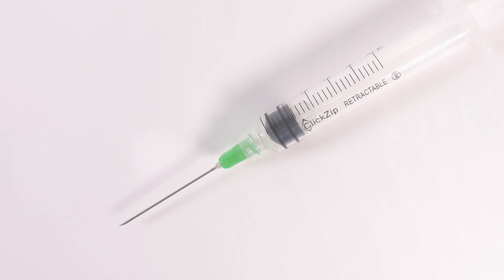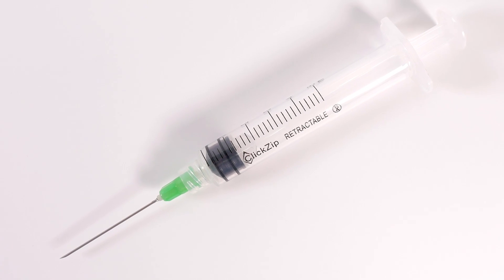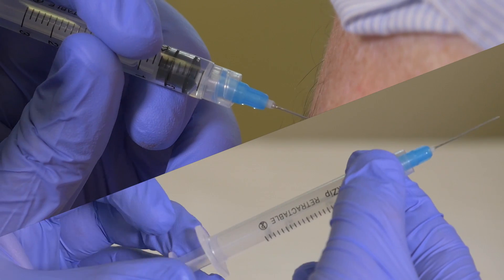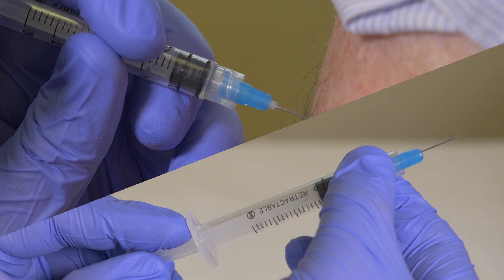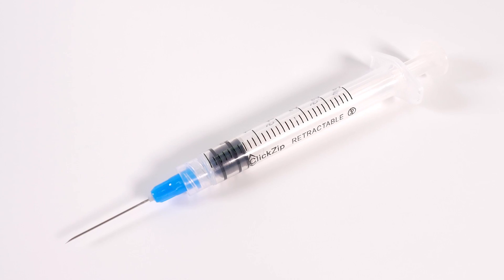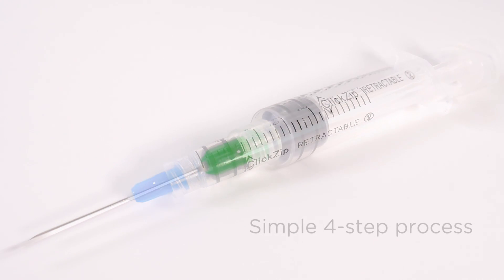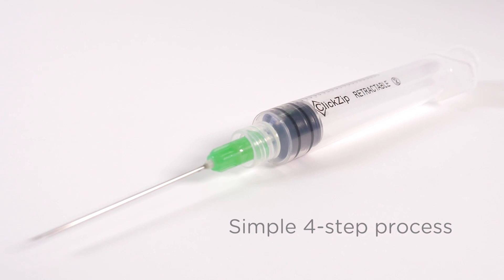The ClickZip Safety Syringe is designed to be used exactly like a traditional syringe, with the benefit of a manual retraction mechanism that clicks and zips the needle safely back into its barrel. It is easy to operate with minimal or no training required, and provides the user a simple four-step process.